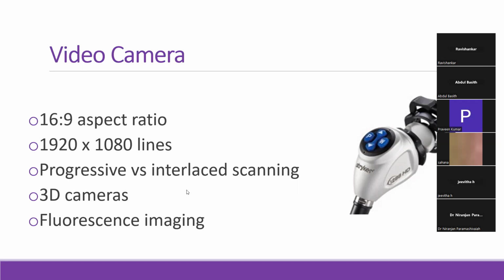Okay. What is this interlacing scan? What is the scanning? Progressive versus interlaced scanning. What is all this, Lakshman, asking these silly questions? Right? But when we use a camera, I honestly believe you must be aware of these things, because when you are a consultant surgeon, the administrator will ask you to select a particular system. Unless you know these aspects, you will not know which one to select. And if you don't select the right one, your working conditions will not be as good as they ought to be. Okay, this is not just theoretical. This is of very practical significance.